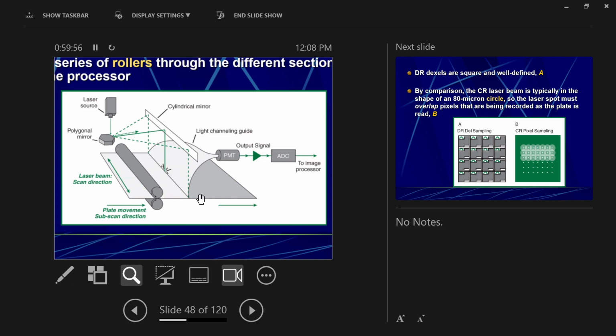Then it samples the next row. Then it scoots in again, samples the row after that. This happens kind of fast, but it samples row by row by row along the entire plate as the plate is drawn in, okay? Each of those rows, when sampled, each spot when sampled, will emit some light. The computer knows where the laser is at on the plate, where it's sampling, okay? When the laser hits the plate at the spot that it's sampling, light's gonna come out, and that light will be captured by fiber optic cables, okay?